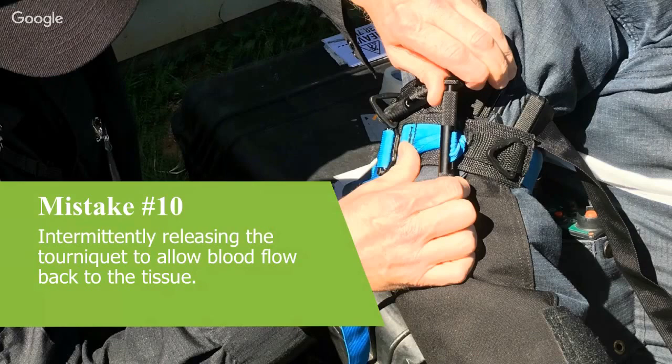Certainly, the TCCC committee has agreed on 2 hours being the upper limit of when you want to review your tourniquet. So 2 hours is a safe window where you're not going to have done permanent damage, and you're very safe to leave it on for that period of time. So if you're within 2 hours of getting to a destination medical facility, so in the civilian environments, paramedics, if you put a tourniquet on, and you're within 2 hours of a facility, don't even think about taking it off. Get them to the facility.